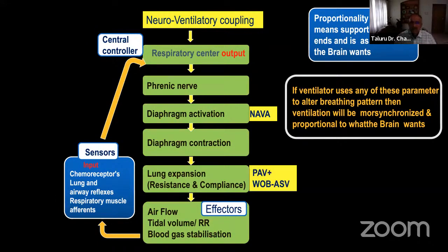There are some other modes which consider resistance and compliance much better, where the airway sucking in is communicated to the ventilator. Those are proportional assist ventilation and adaptive support ventilation. If available, those are better physiological modes. And the rest of the modes, like PRVC and volume support, are all minute ventilation assurance modes. They are not very physiological. I would say they are better than you standing there and setting every 5 minutes. They are more superior in setting, not more superior physiologically in breath delivery.